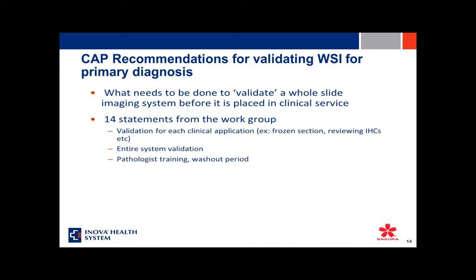And they also talk about pathologist training. Pathologists have to be adequately trained before using the system because they are the ones who are crucial in determining your accuracy studies when compared to the digital readout. And then they also recommend a washout period of at least 2 weeks. For our studies, we used a washout period of greater than 3 weeks. I think the idea was that the pathologists would forget what they saw on the glass slide when they were looking at a digital slide.